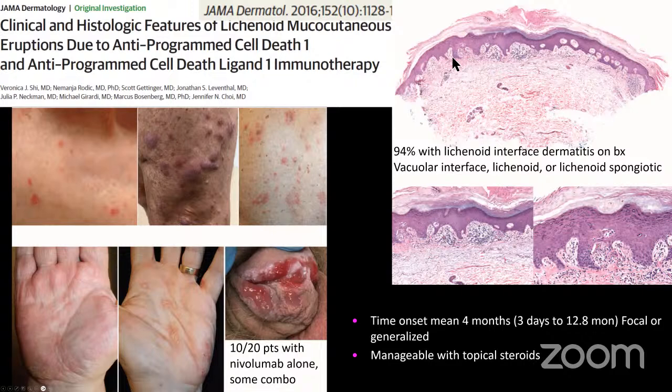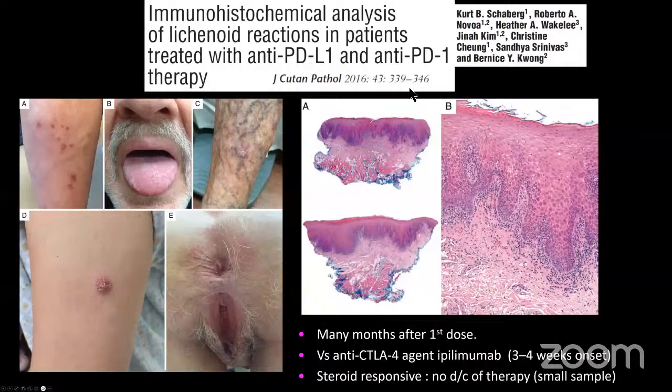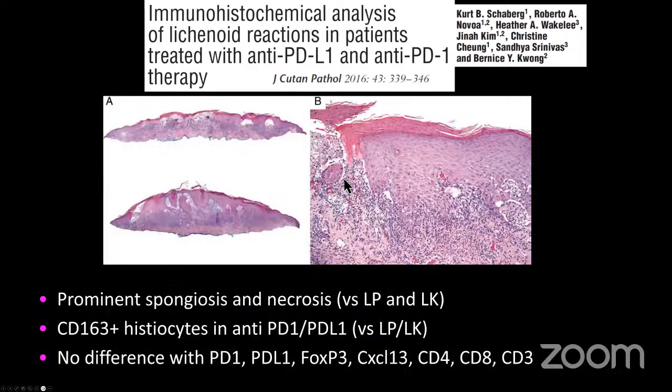So you can recognize it usually just like lichen planus a lot of times, with the infiltrate hugging the epidermis. You might have some spongiosis and some other features. But when I've seen it, it's been very lichen planus-like. You can see it really hugging the epidermis. This one is not as pointy as you would have with lichen planus because it's in the mouth. Sometimes you won't have the same lichenoid tissue reactions in the mouth as you do in the skin. But again, here, very lichen planus-like.